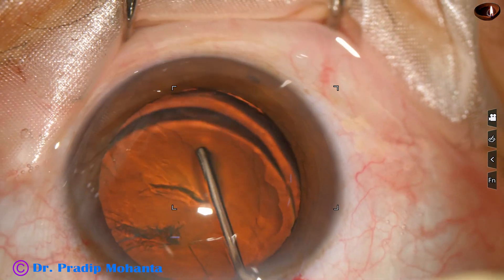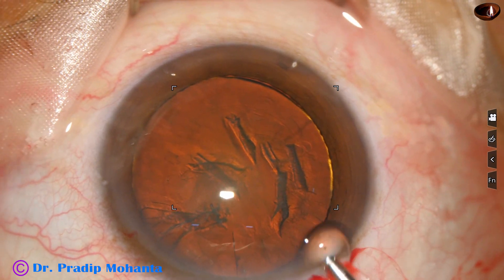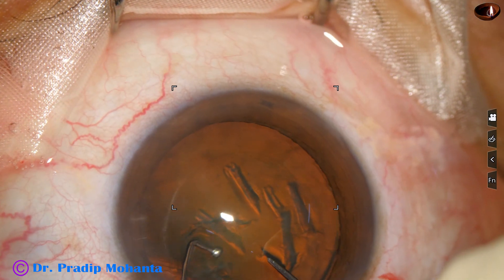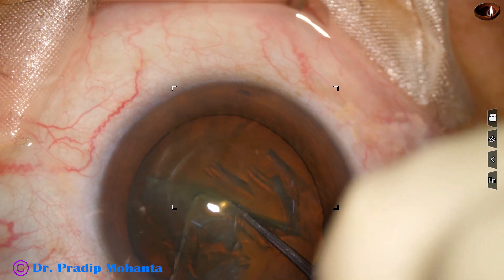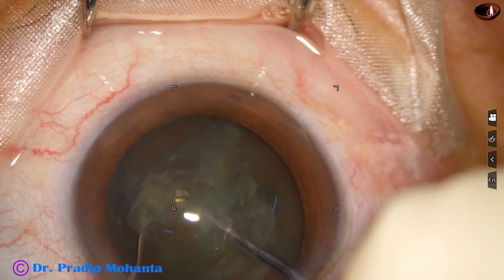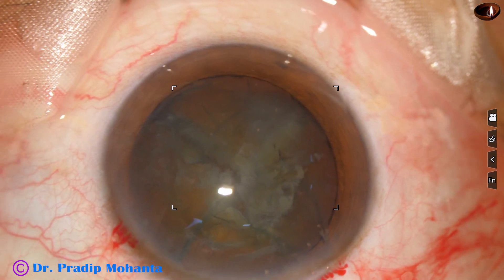For gummy cataracts seen in diabetics, the best option is a pre-chopper — this is Dr. Sohail Khan's pre-chopper. The pre-chopper and sustainer divide the nucleus into two hemi-nuclei, and then each hemi-nucleus is subdivided into pieces, giving us four nuclear fragments.